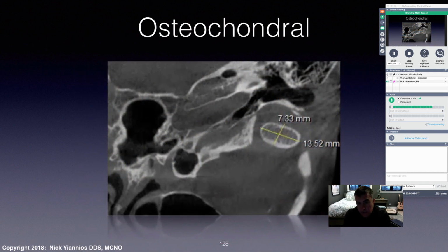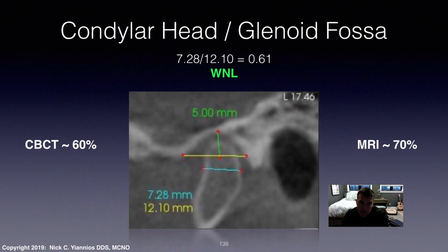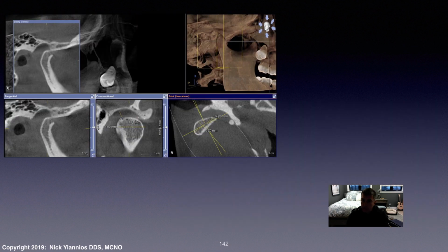It's an XG3D that only shoots an 8 by 8 centimeters, so I can only get one joint at a time. If you look at the cross-sectional view or the coronal view in the center of the screen on the bottom, 0.61 times 100 would be 61%. Slightly adapt, not really though, but the left side's a nightmare. That thing's falling apart. That is very unstable and maladaptive.